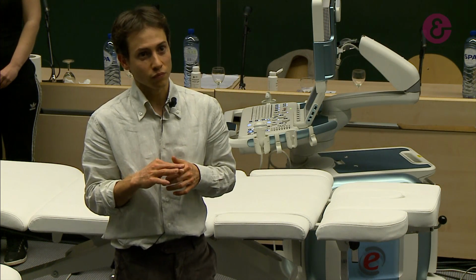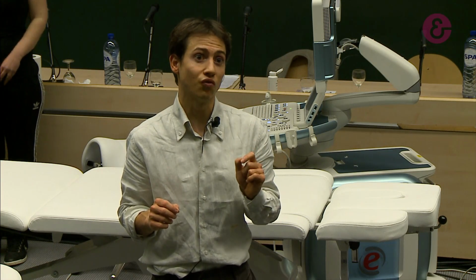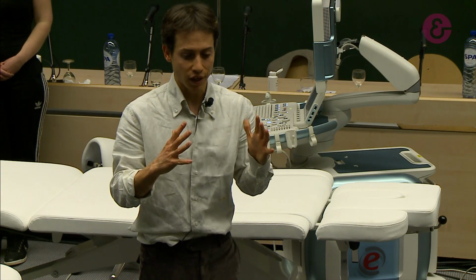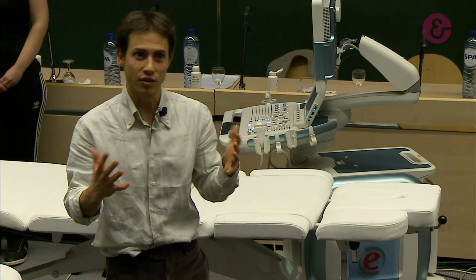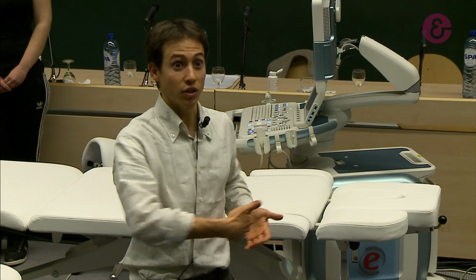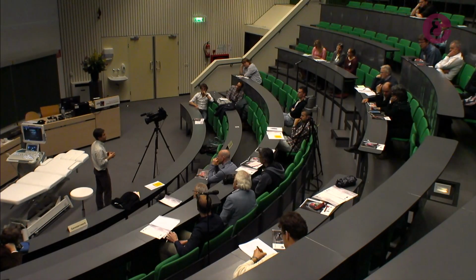You're looking also at the difference between left and right? So yeah, normally I like to take measurements of muscles. In particular, from my clinical examination, I can see that there is a shift to one side, there is a scoliosis, and so I can hypothesize that there is some hyperactivation of some muscle in a direction. So I like to take measurements and to compare after a treatment if there are differences or not.